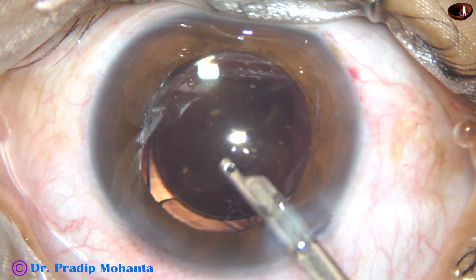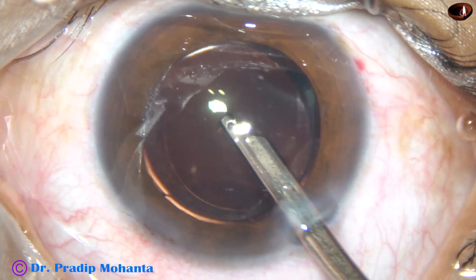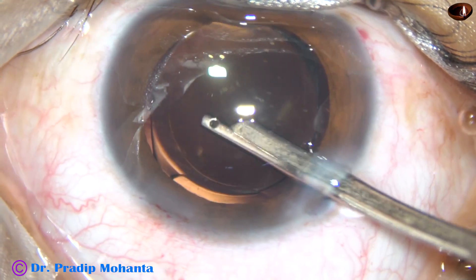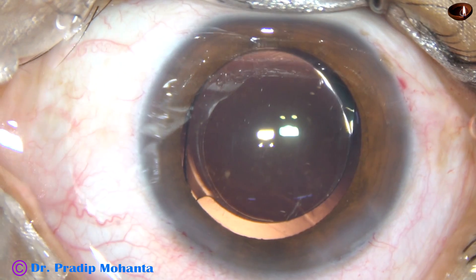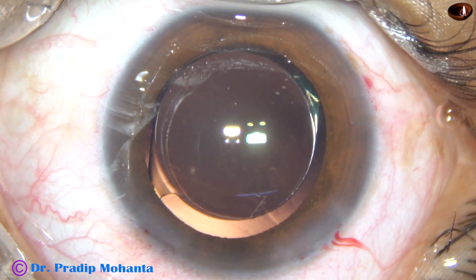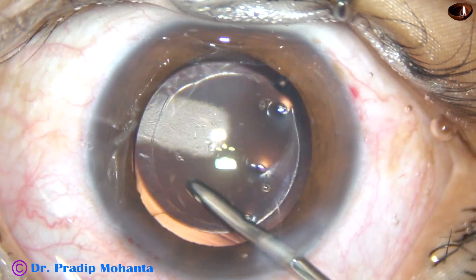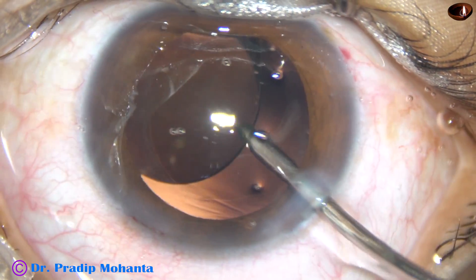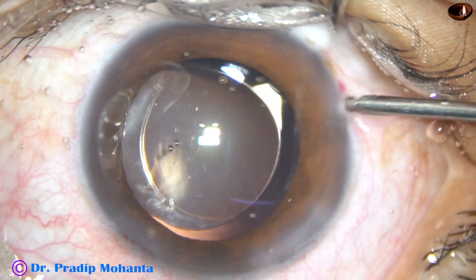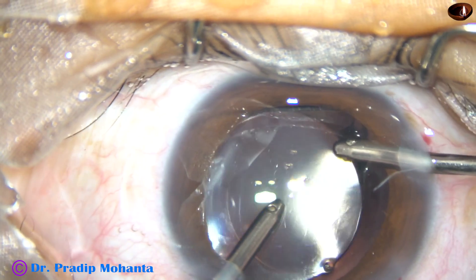Now the viscoelastic substance — that is 2% hydroxypropyl methyl cellulose — is irrigated out first with the Simcoe; you can use whatever you want. Faster is probably the coaxial I/A. Now I am using the irrigating probe of bimanual I/A and irrigating for some time. The irrigation removes the viscoelastic substance very nicely. Go behind the lens, irrigate the capsular bag, and finally use irrigation and aspiration together to remove the viscoelastic substance.